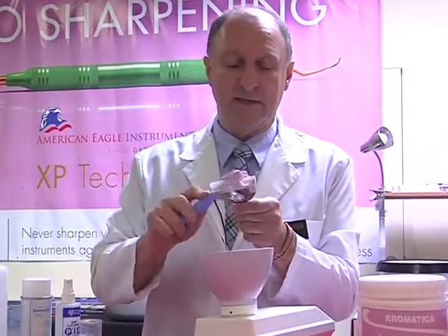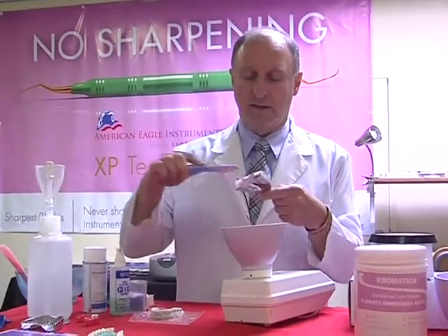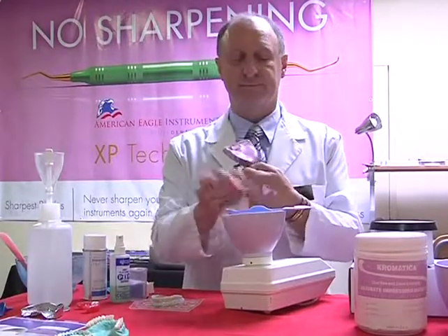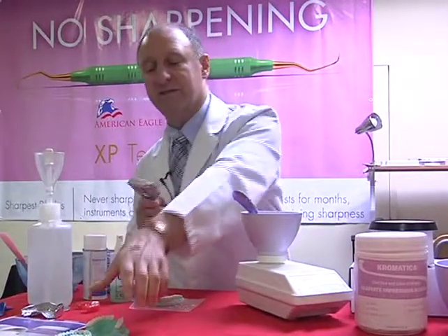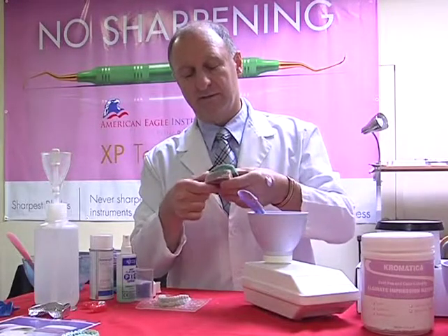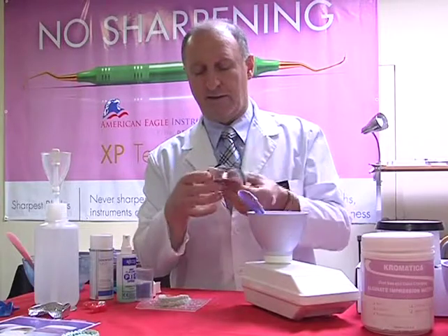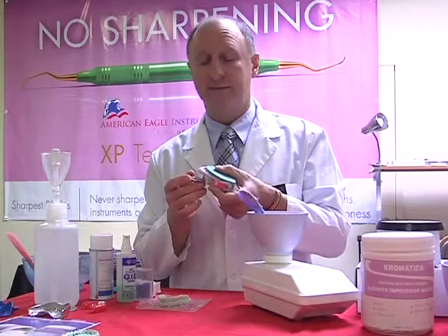At this point, I'm now going to unload the material. Again, taking a small amount of that material on the back of the patient's hand. And at this point then I can actually ask the patient to watch whilst this turns white. I'm then going to go into the mouth to take our impression. Again, another 20 seconds inside the mouth, nice and rapid.